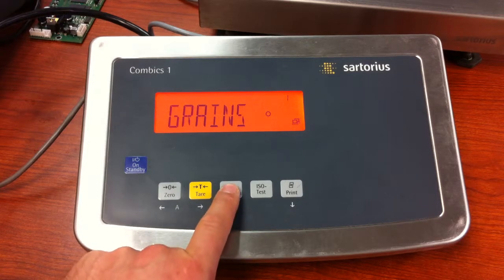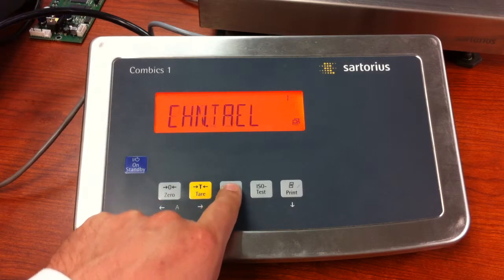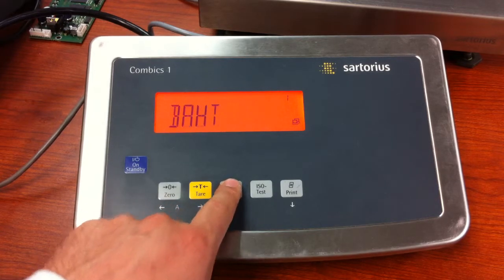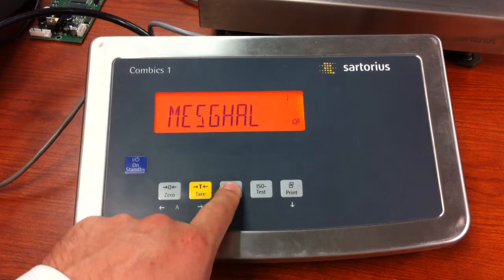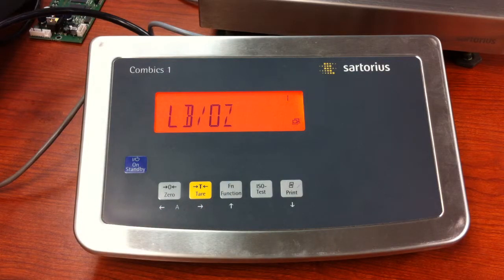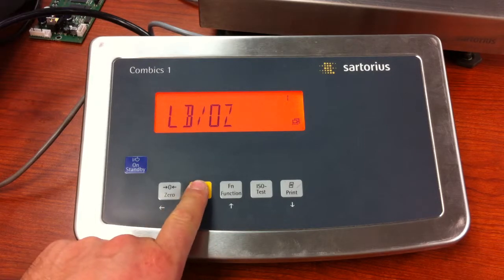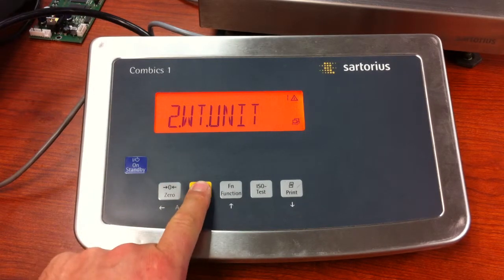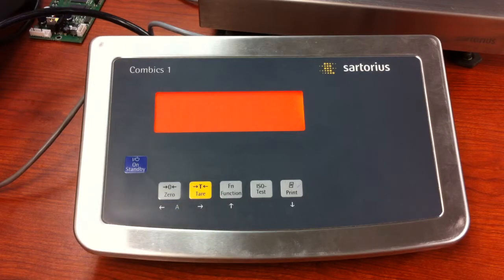Now you can set the second unit of measure to anything that is in our list. Press and release the function key until you find the second unit of measure that you want. I'm going to set it up for pounds/ounces. Press and release the tear key — you get the little circle. Now press and release the zero key once, then press and hold the tear key until the unit resets.